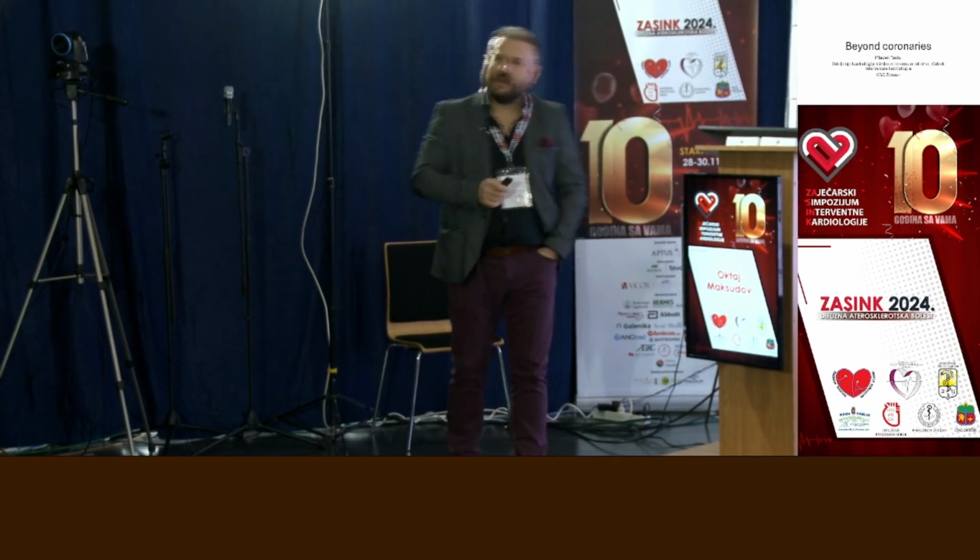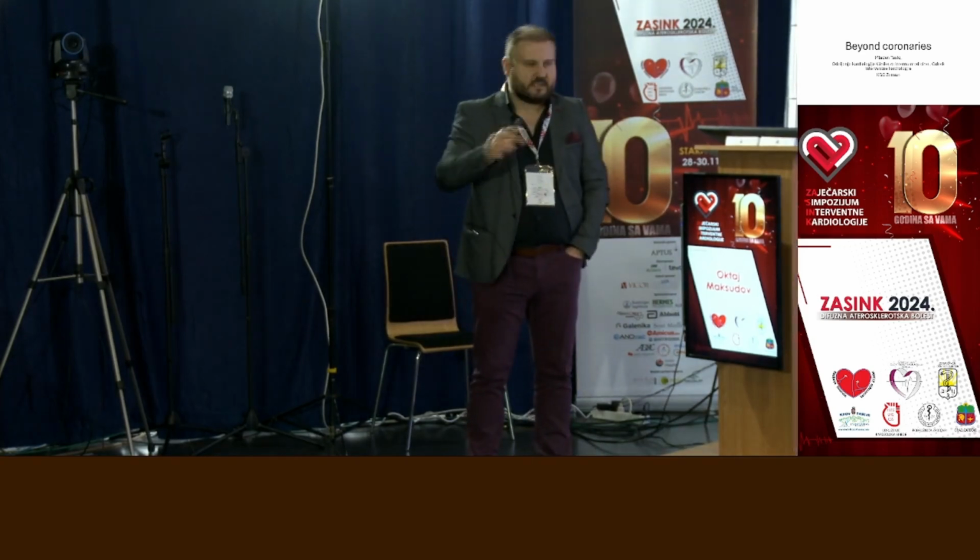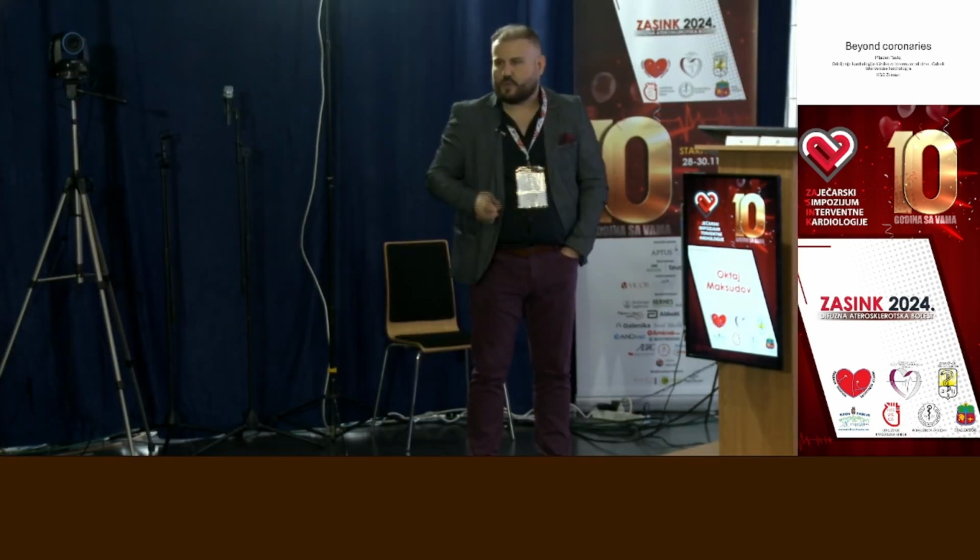I agree with you, but the first procedure wasn't done by me. I'm in the second procedure where I used the snare and put the stents, and the third procedure with DCB and the distal ulnar, where the videos weren't shown. Okay, thank you.